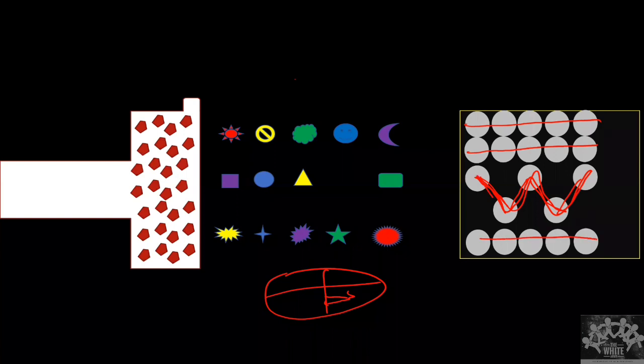Now if this is moving like this, we know that this is one heartbeat. This is one closing of the mitral valve, and then the closing of the mitral valve in the second beat. So if I measure the time between these two, it is the time of one heartbeat. Okay, that's how we measure the heartbeat. That's how you see a moving structure in M mode.